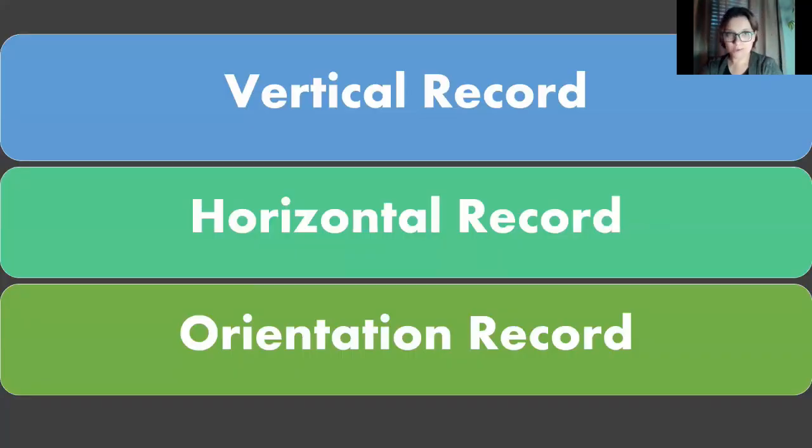No matter which digital try-in you use, whether it's a conventional wax tooth try-in or a monolithic try-in, we're utilizing our try-ins to establish these three things. We need to establish the vertical record, which is the vertical dimension of occlusion. We typically teach the technique of vertical dimension of rest, minus 2 to 4 millimeters, to get our vertical dimension of occlusion. There's a ton of ways to do it. There's nothing wrong with any of them, but you do need to establish a patient's vertical dimension of occlusion and where they can function most comfortably.